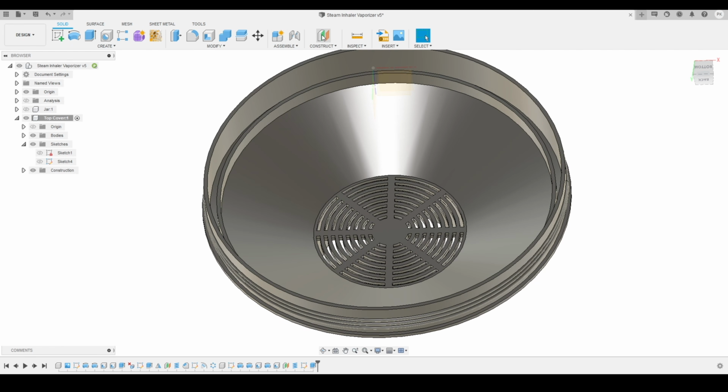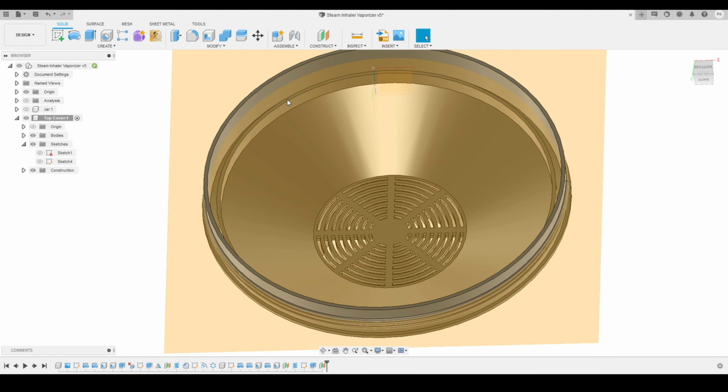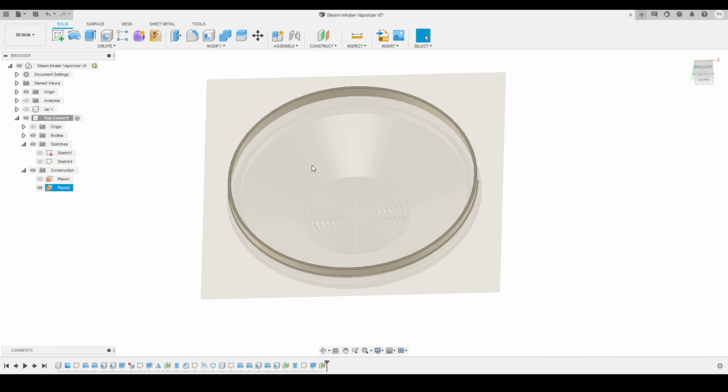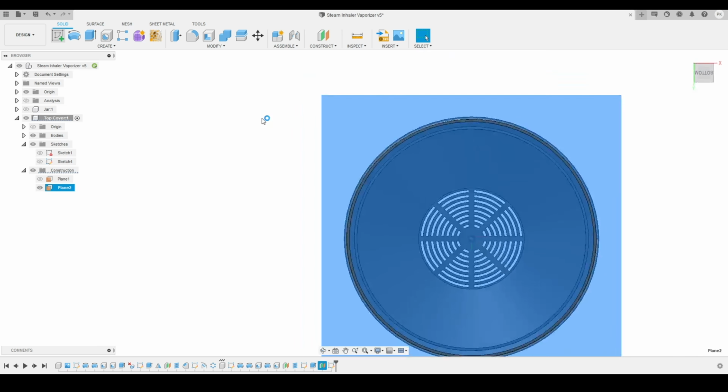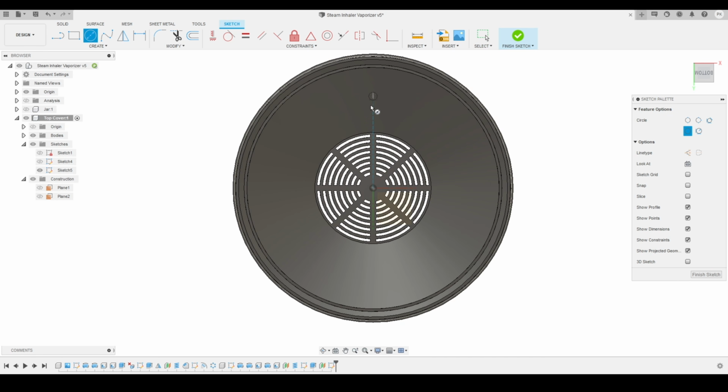Now I will activate this offset plane tool, select this face to offset, and provide the offset distance. Here you can see. Now I will expand the plane, turn on the plane, select the plane, and click on the create sketch tool from here. Here you can see my sketch tools are active. I will activate the circle tool and create a circle over here like this. Here you can see it must be in line with the origin.